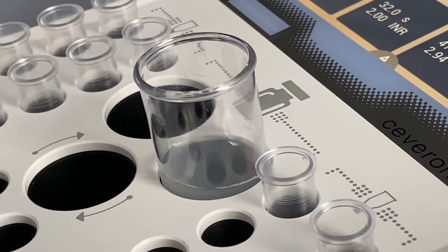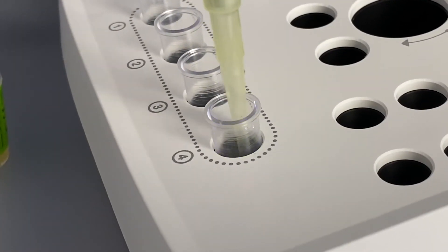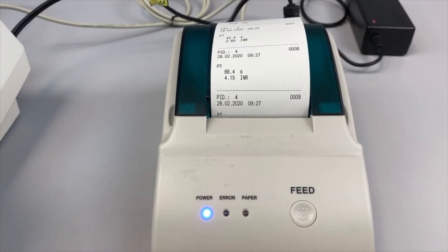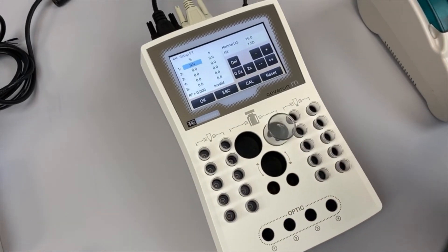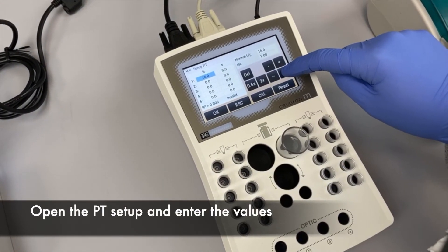After successful calibration, the M series automatically shows the results on the display. If a printer is connected, the results are printed automatically. Pre-calibrated values can also be entered into the instrument.